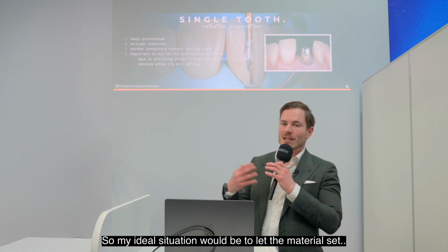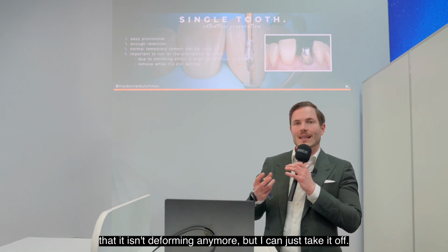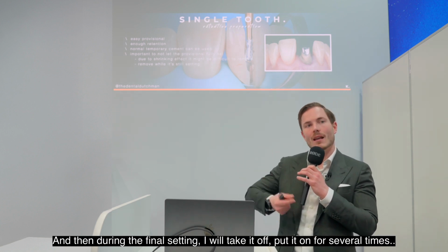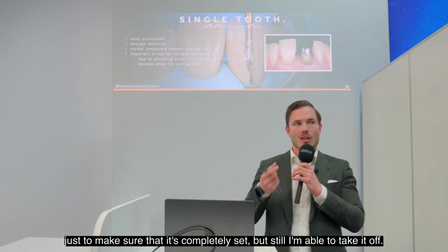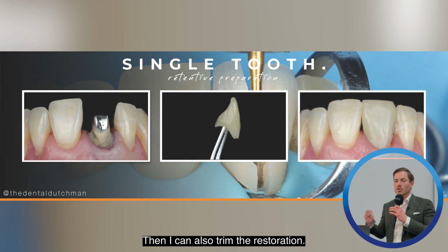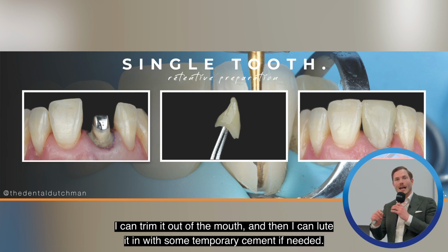So my ideal situation would be to let the material set so that it isn't deforming anymore, but I can just take it off. And then during the final setting, I will take it off, put it on several times, just to make sure that it's completely set, but still I'm able to take it off. Then I can also trim the restoration. So we see on the left the preparation. We see the provisional restoration. I can trim it out of the mouth, and then I can lute it in with some temporary cement if needed.